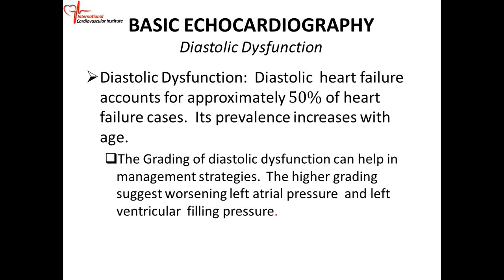Well, you have normal, so you have what normal is supposed to look like. Then you have grade 1 diastolic dysfunction, grade 2, grade 3, and grade 4. So it's important for you to grade it. So when a patient comes to the echo lab and I am reporting on diastolic dysfunction, you have to put a grade, right? So grade 1 is not as bad as grade 2, which is not as bad as grade 3 and 4.